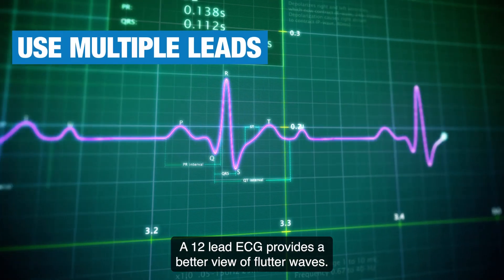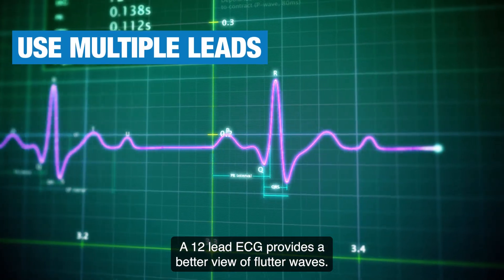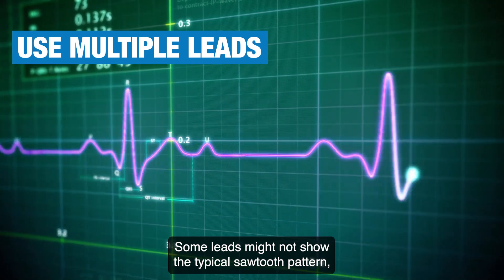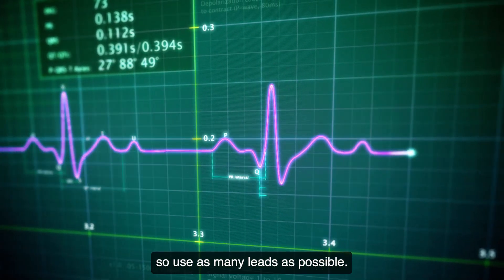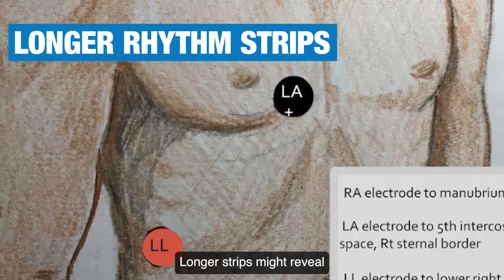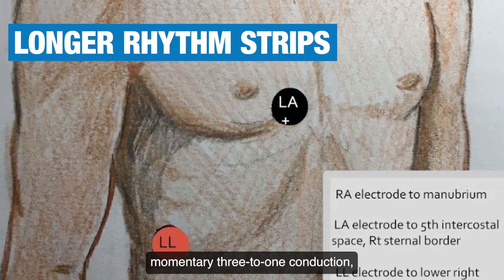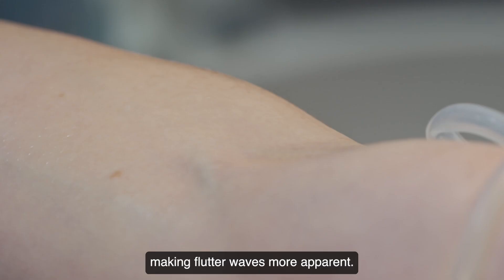A 12-lead ECG provides a better view of flutter waves. Some leads might not show the typical sawtooth pattern, so use as many leads as possible. Longer strips might reveal momentary 3-to-1 conduction, making flutter waves more apparent.